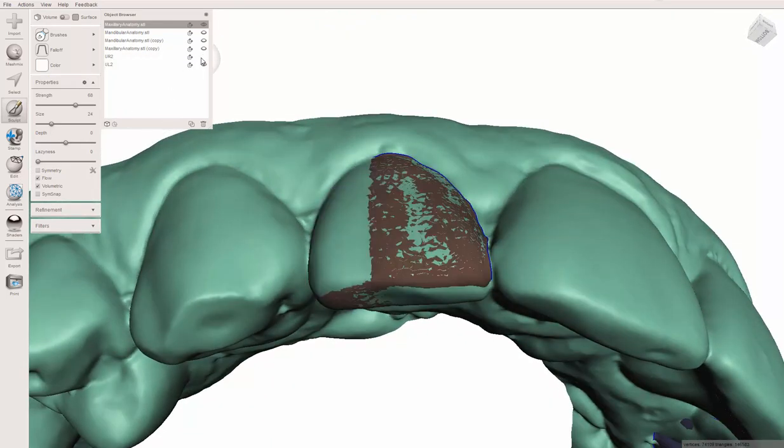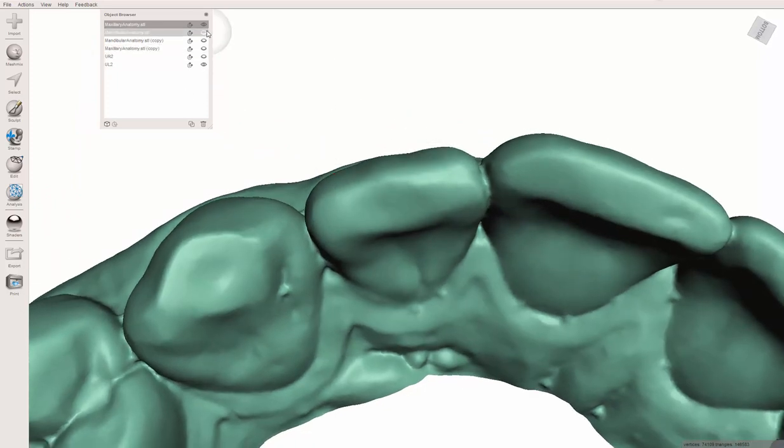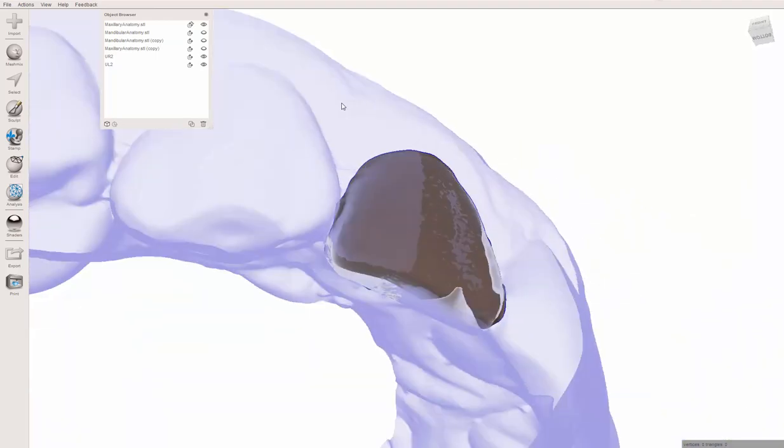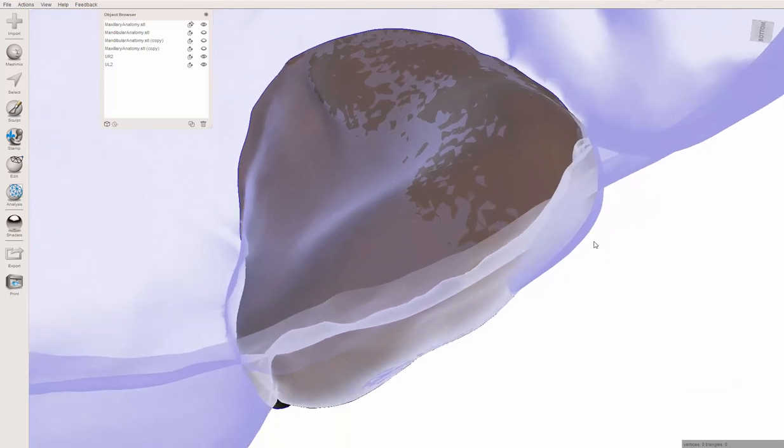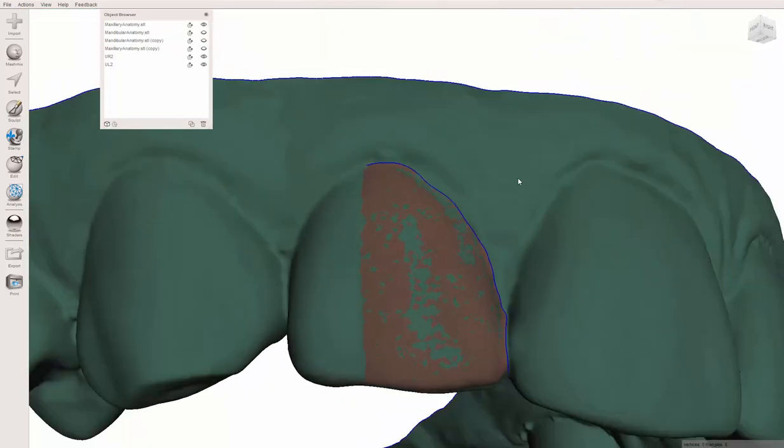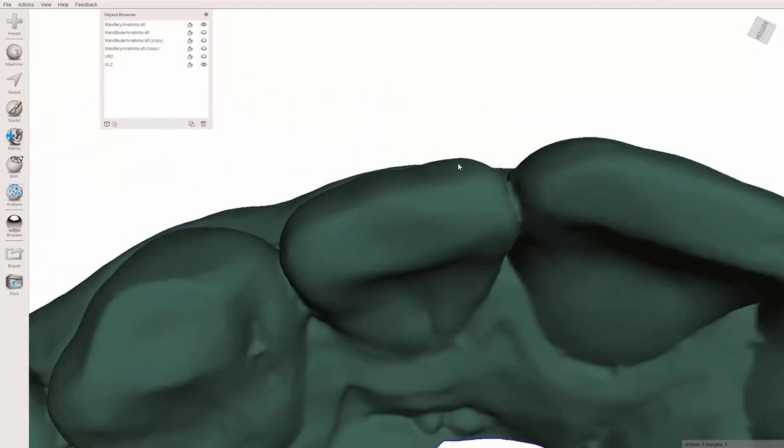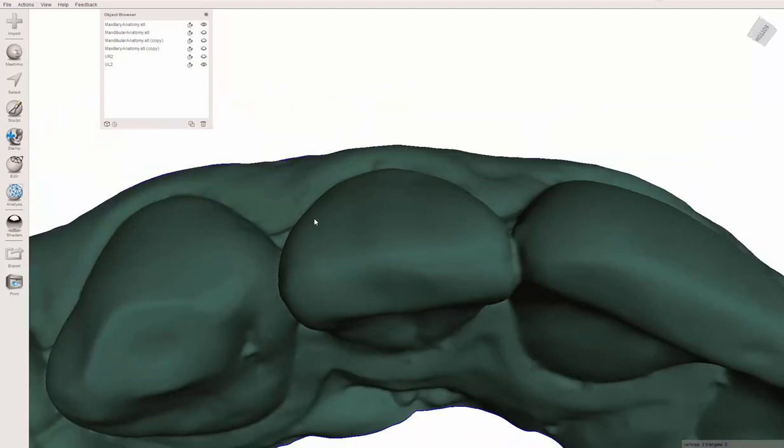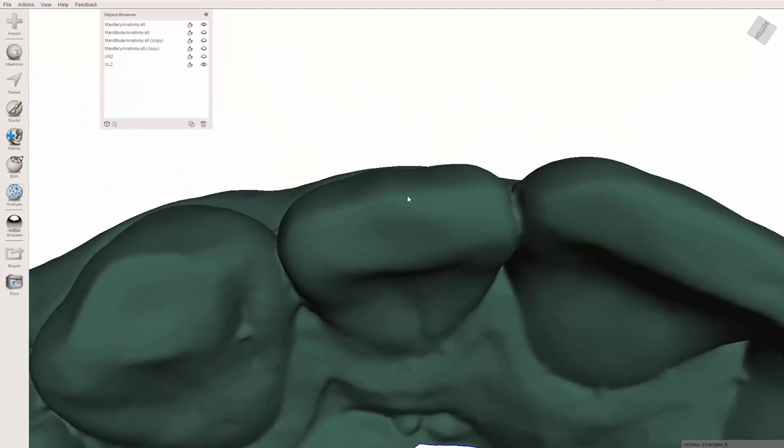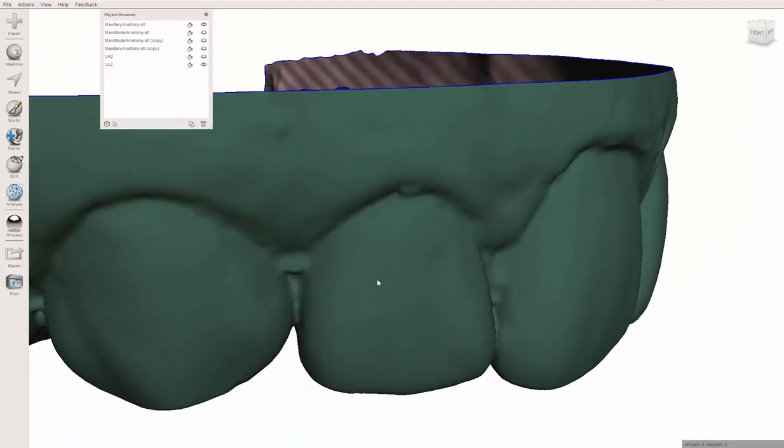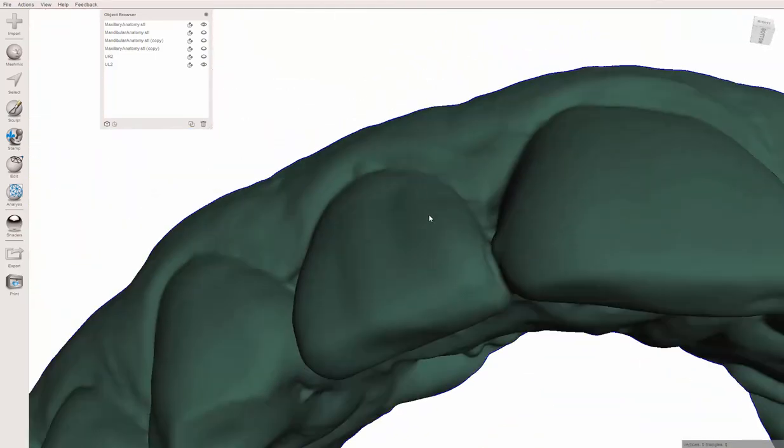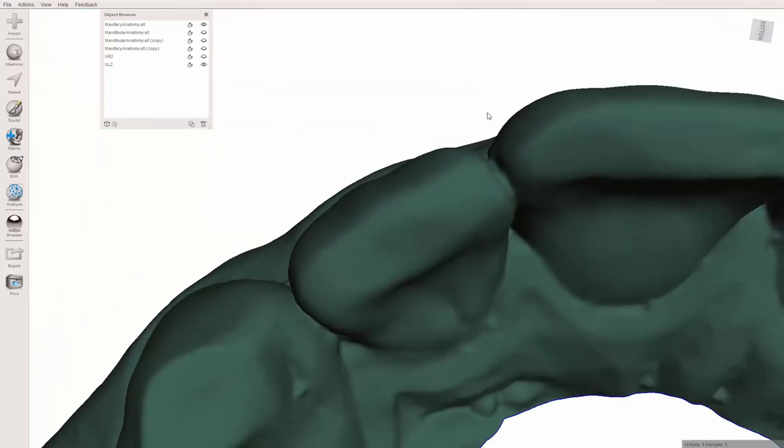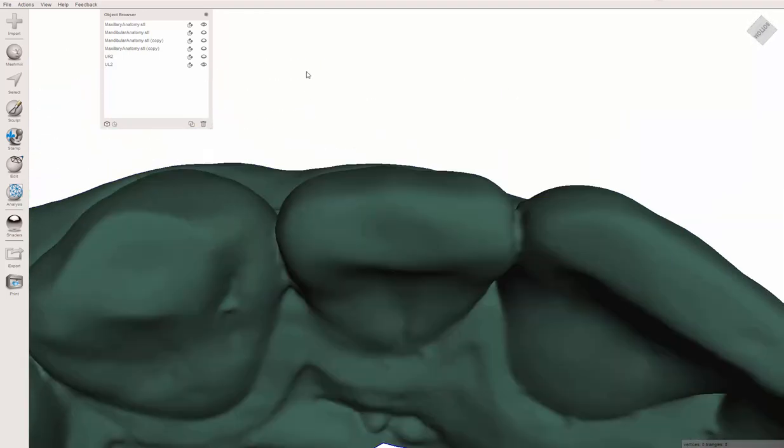So now, technically we're done. I'm going to turn this off. So I've made the tooth fatter than it was. If I turn this to glow, the magnet, you can see the existing tooth position sticks out a ways. You could be done right here, and if you had some thermal forming pliers, you could just make the model from this. In those areas where the tooth needs to push forward, put a dimple here, put a dimple there, that will twist the tooth. That's probably the most effective way to actually do rotation.